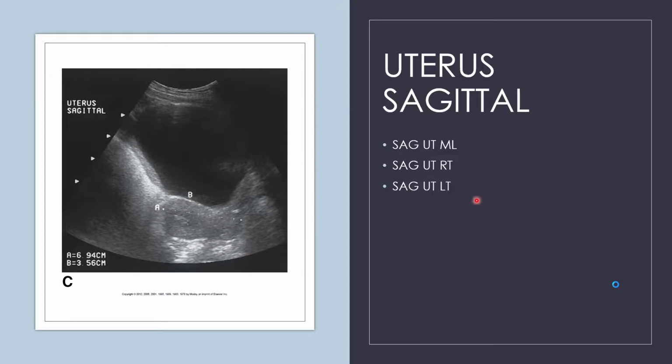At your facility, you may be required to take midline pictures, right and left. This is just a standard protocol for a more diagnostic lab, so you may not be required to have all these images. I just like to put these in here just in case.